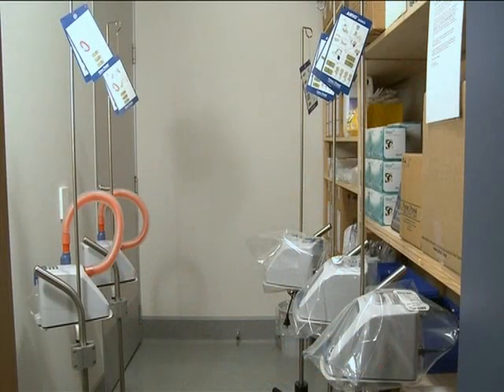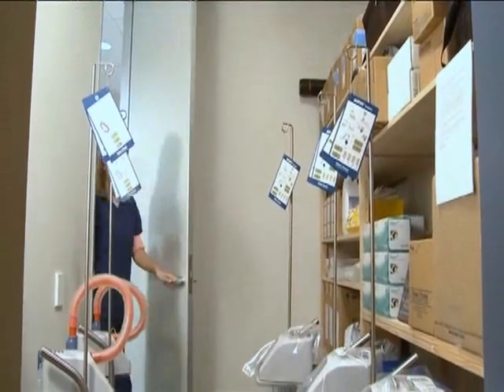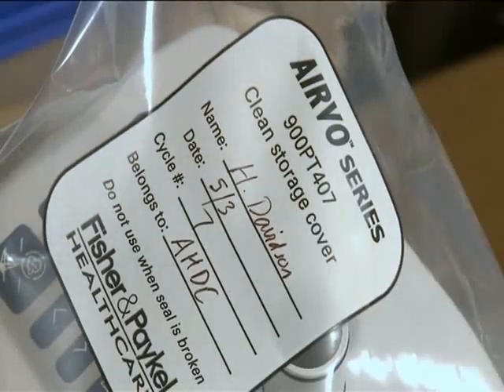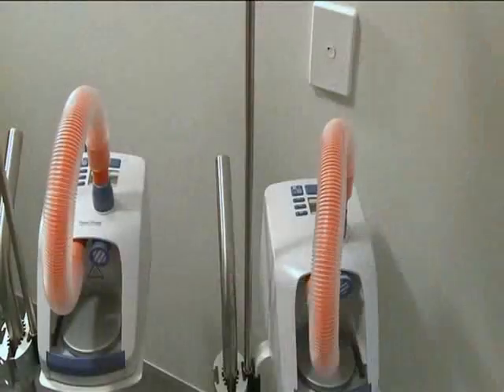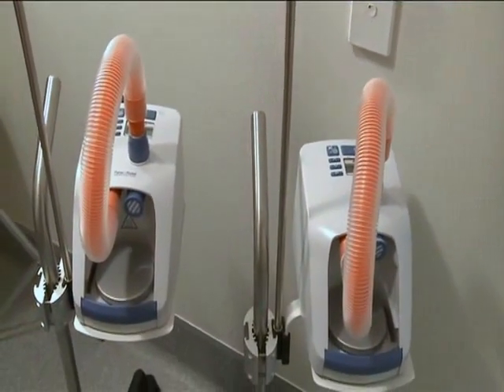First, we'll need an Evo humidifier. The Evo needs to be cleaned and disinfected before it can be used on a new patient. We'll talk about cleaning and disinfection in Chapter 4. Check that the clean storage cover is sealed and its label completed when you collect an Evo humidifier from storage. Some hospitals leave the red disinfection tube in place instead of using the clean storage cover to indicate cleaning and disinfection has been carried out.